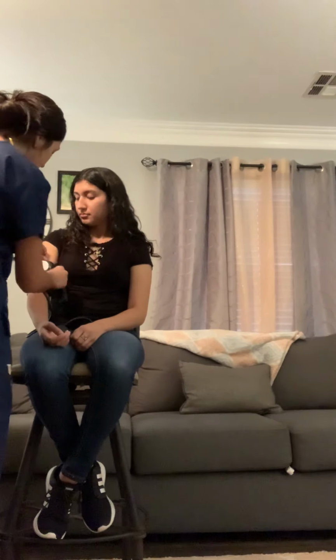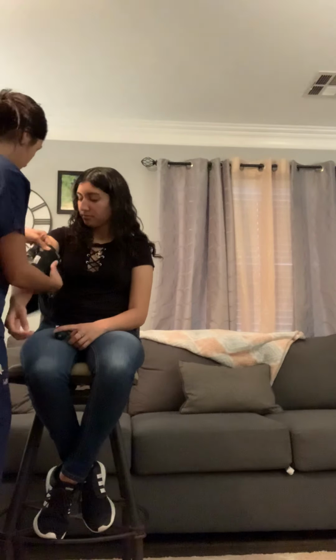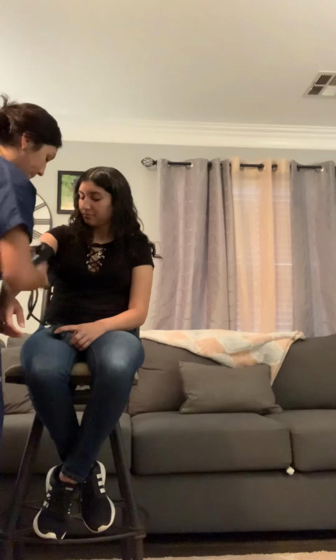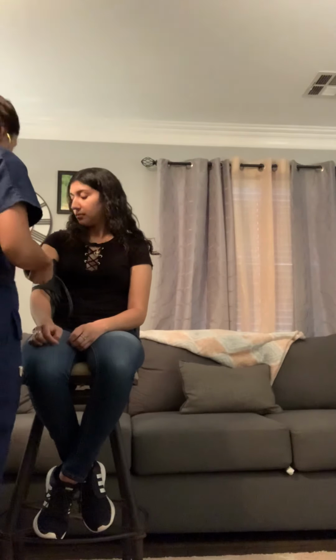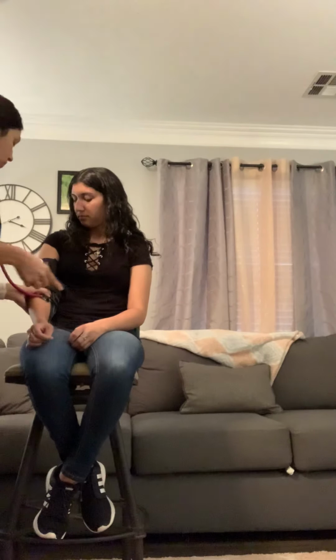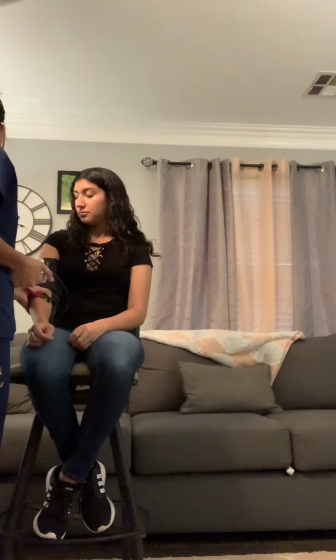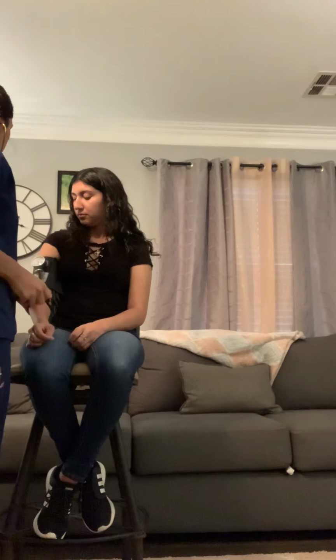Actually, let me fix it. It slipped. Maybe it wasn't snug enough. Okay, go ahead and rest your arm. I'm going to do the same thing, just auscultating instead of palpating. I'll make sure to go about 20 to 30 above your original systolic pressure.